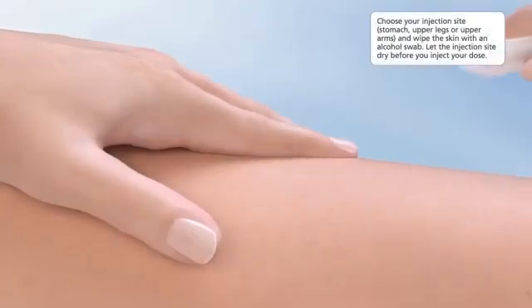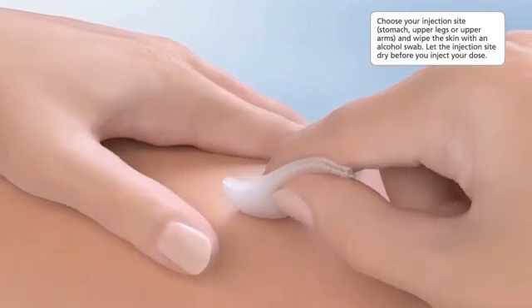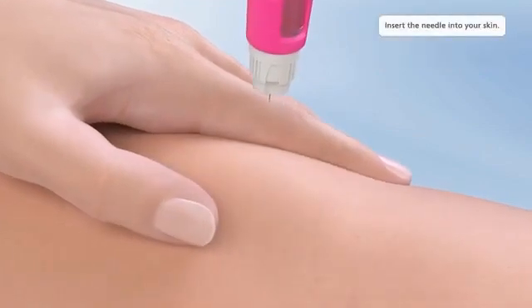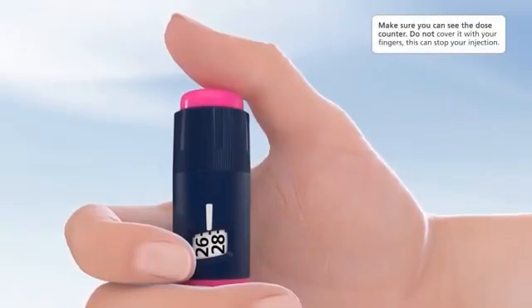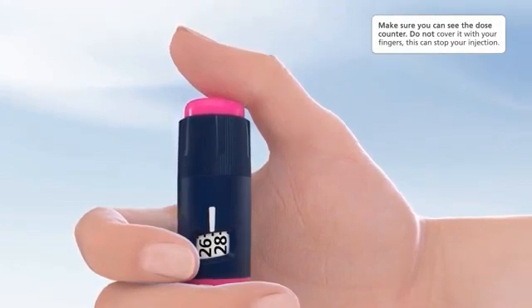Choose your injection site — stomach, upper legs, or upper arms — and wipe the skin with an alcohol swab. Let the injection site dry before you inject your dose. Insert the needle into your skin. Make sure you can see the dose counter — do not cover it with your fingers, as this can stop your injection.